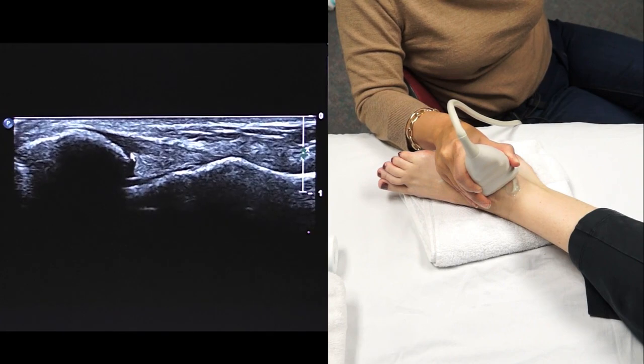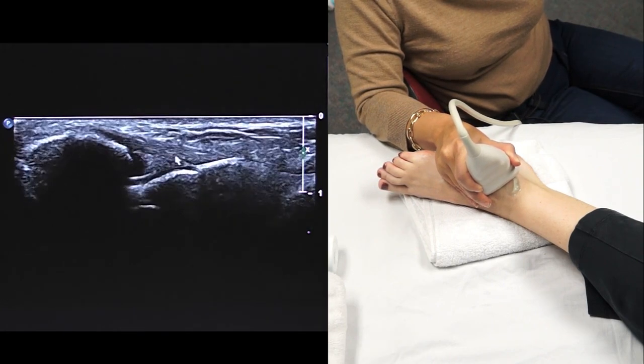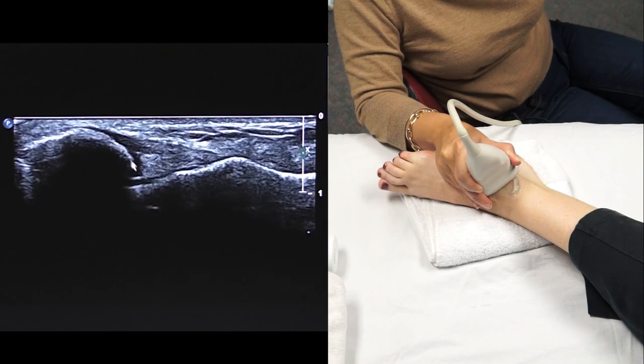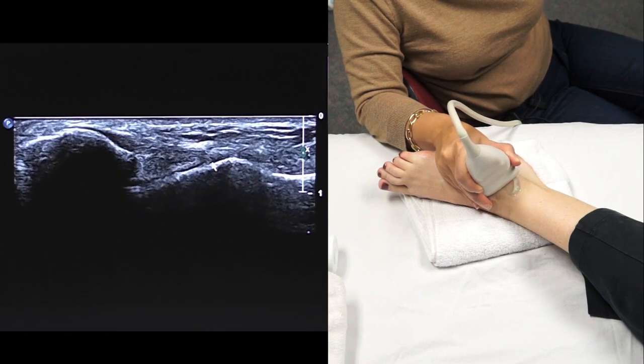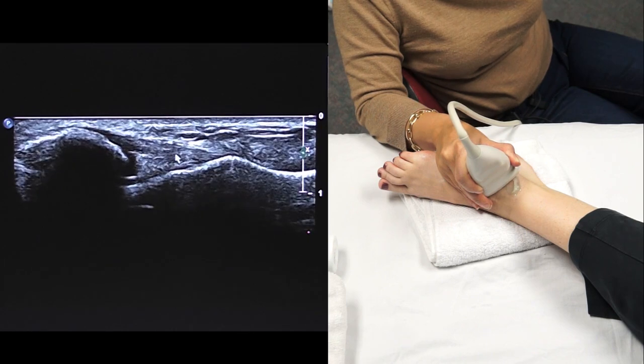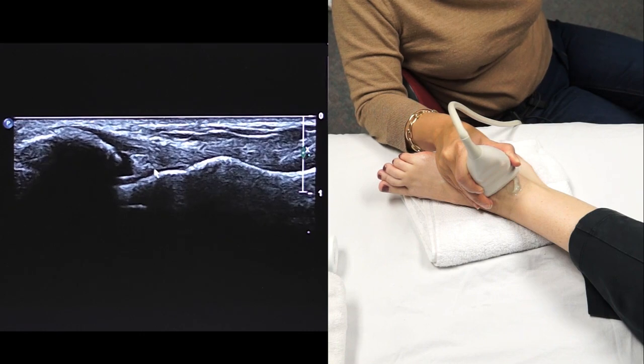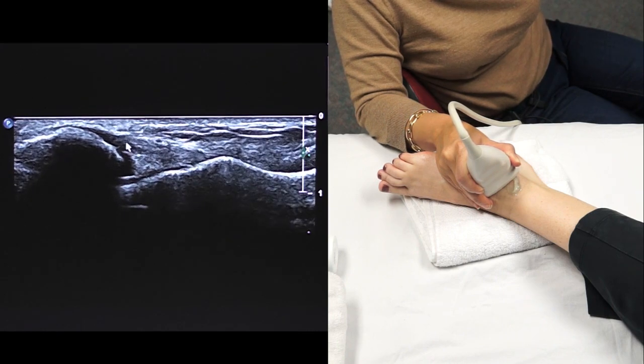See, now here we can see the ligament stretched across. We see that it is intact. We see nice, smooth, bony surfaces at their attachment sites. But this is one way that you can bring the ligament into view. You can also have the patient plantar flex to see if there is instability across that joint or widening across that joint space.